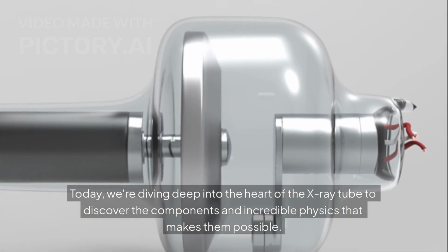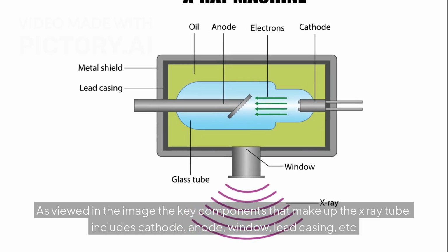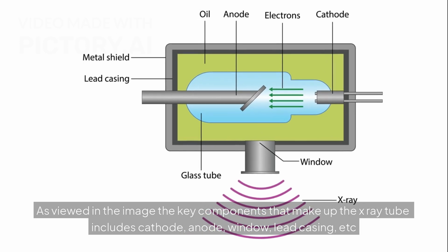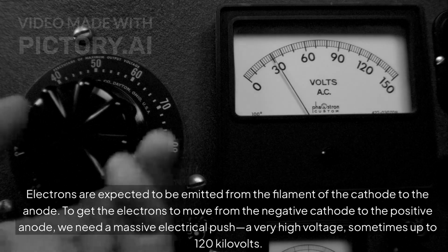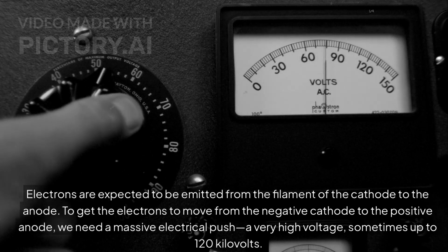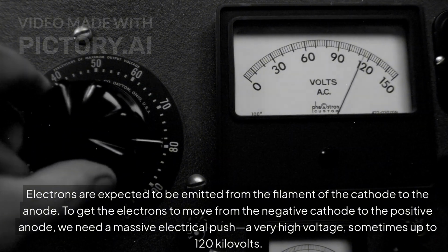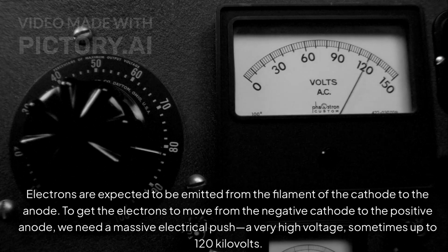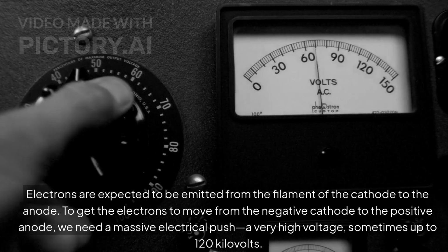them possible. As viewed in the image, the key components that make up the X-ray tube include the cathode, anode, window, lead casing, etc. Electrons are expected to be emitted from the filament of the cathode to the anode. To get the electrons to move from the negative cathode to the positive anode, we need a massive electrical push, a very high voltage, sometimes up to 120 kilovolts.